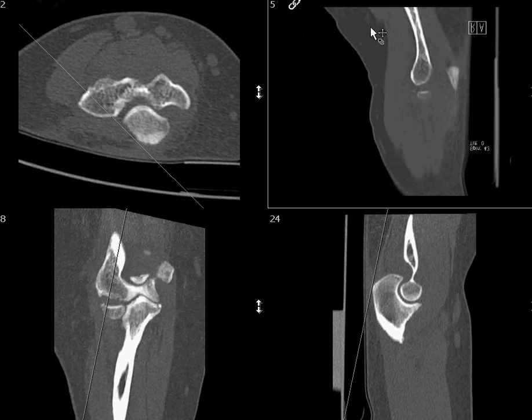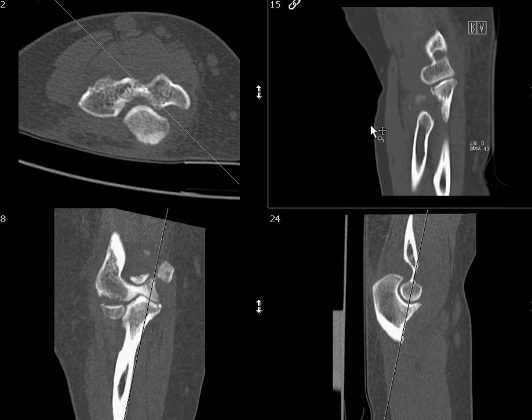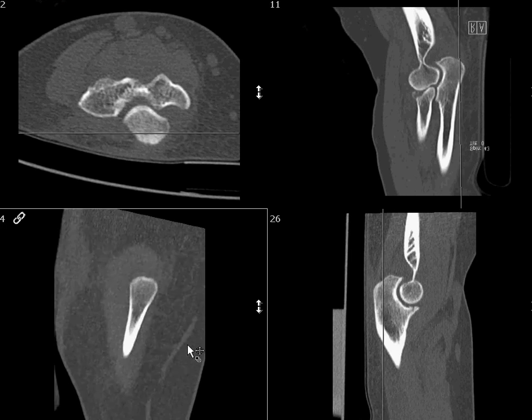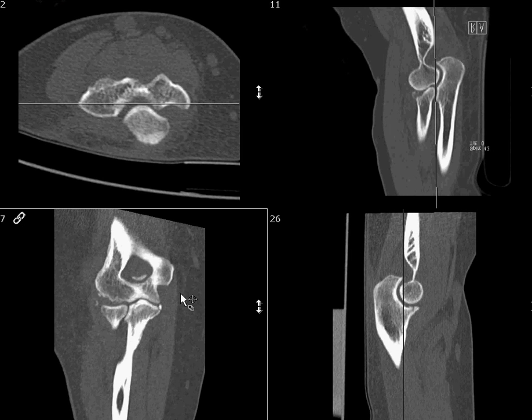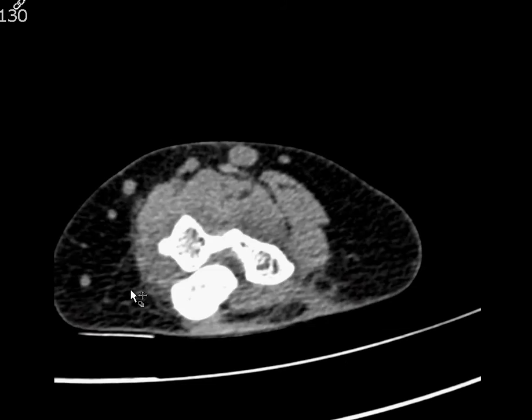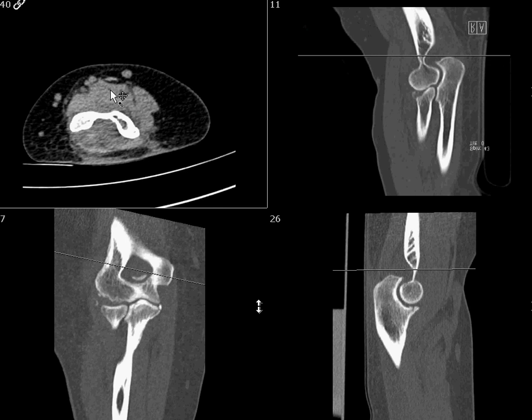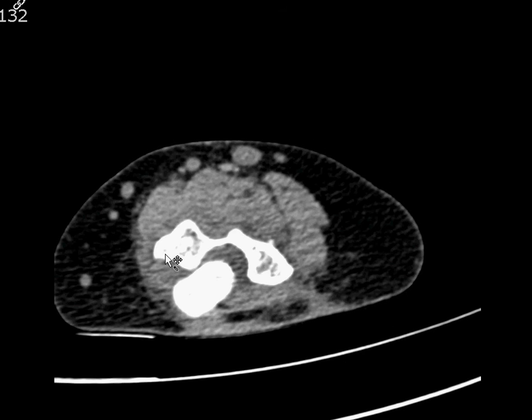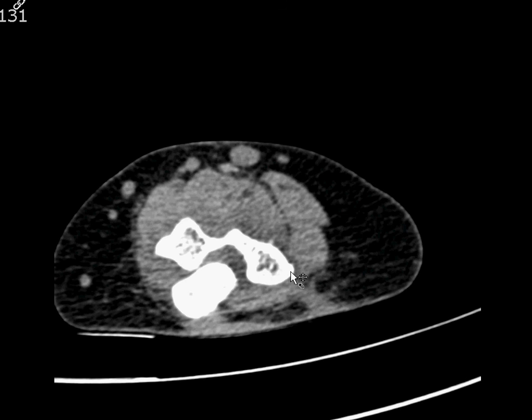So again, the keys are: based on your axial images, find the epicondyles and draw a line between them. That's going to be the axis you use for coronal images, and orthogonal to that will be for sagittal images. Thank you.